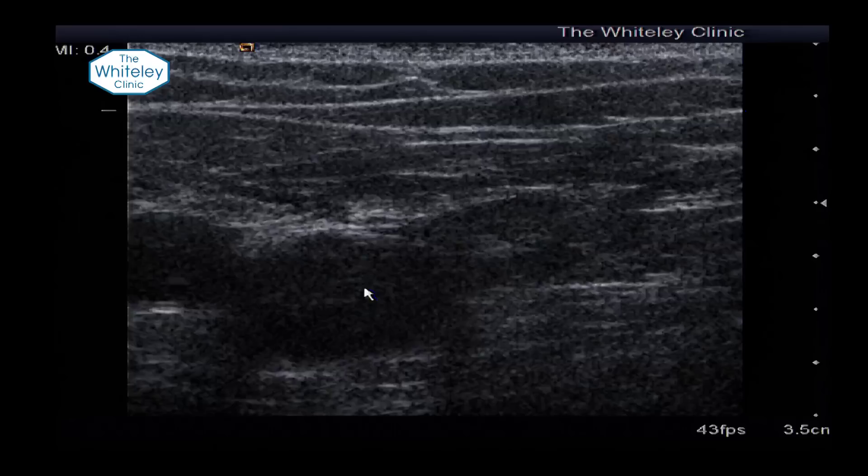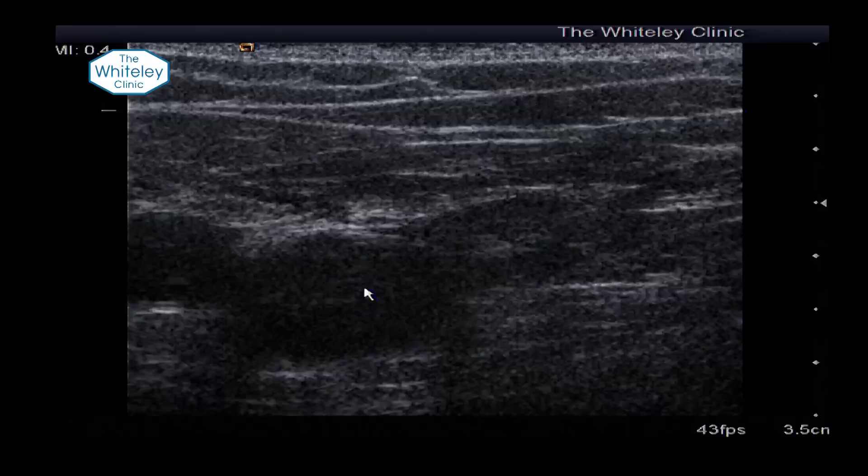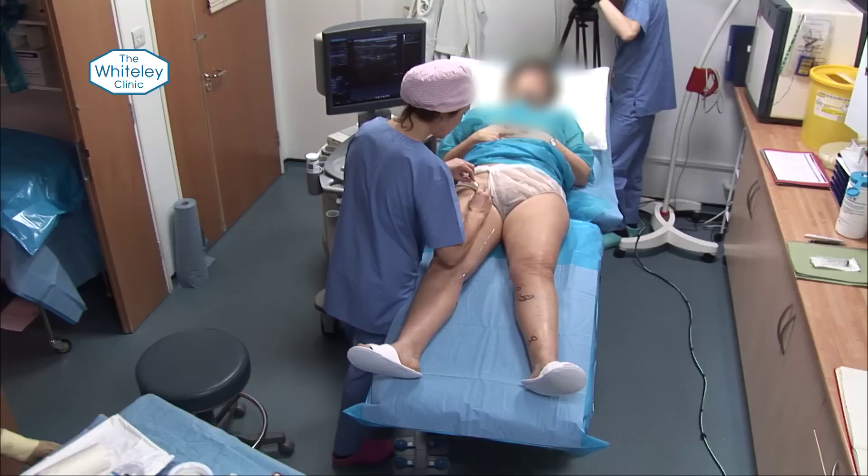So that's the deep vein and this is the superficial one just here. We want to destroy that vein right up to the groin, so we just mark the top location.